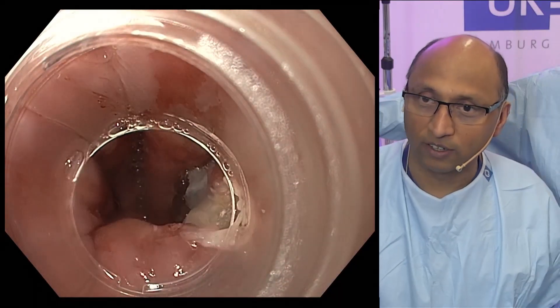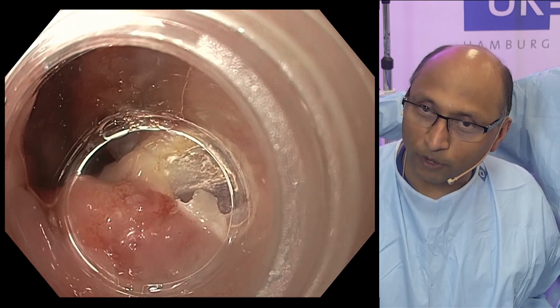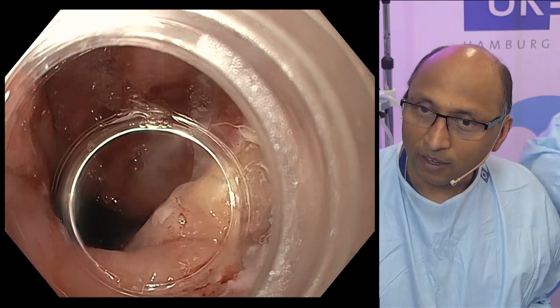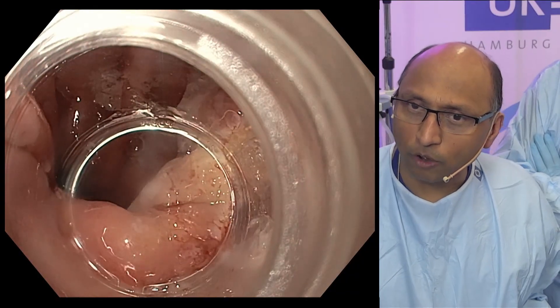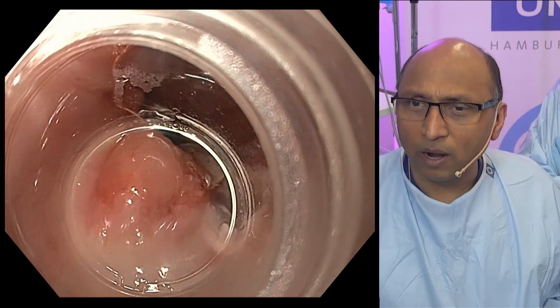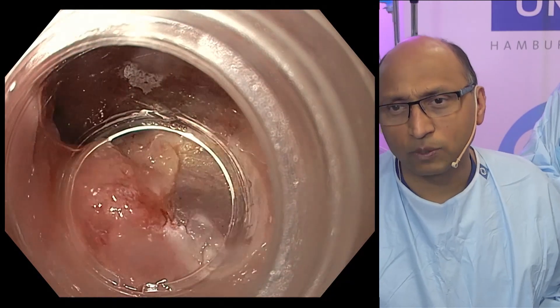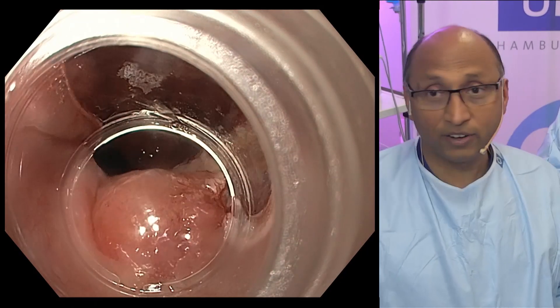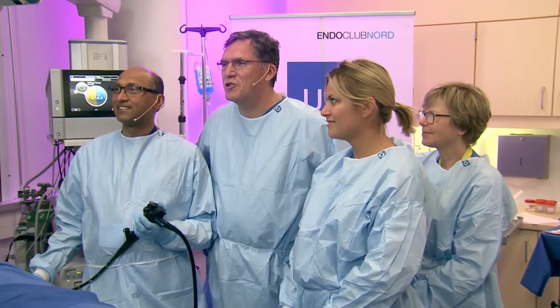Perfect coordination. First thing — no perforation, no big vessel there. I think we might have got most of it but I still feel the margin on the left side looks suspicious there. So we should take another bite. You agree?